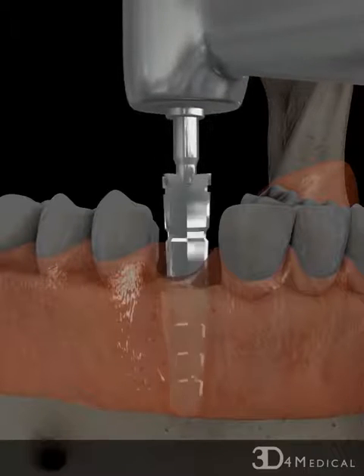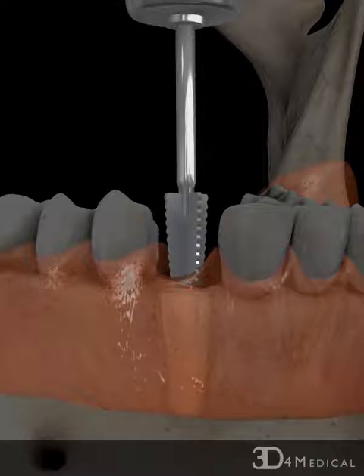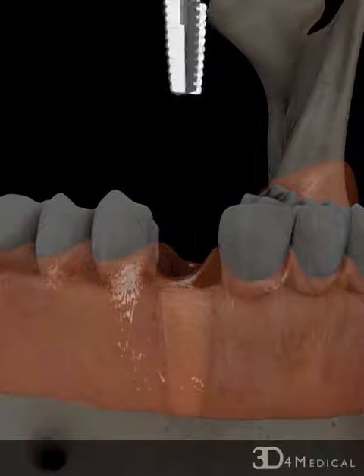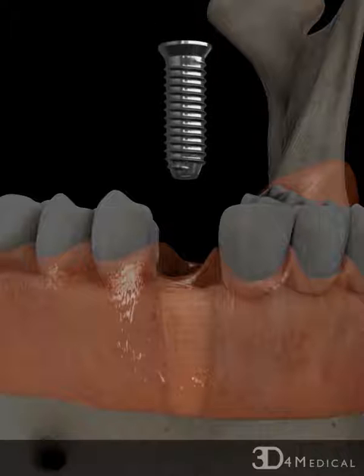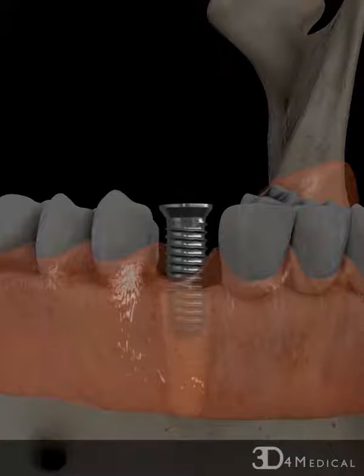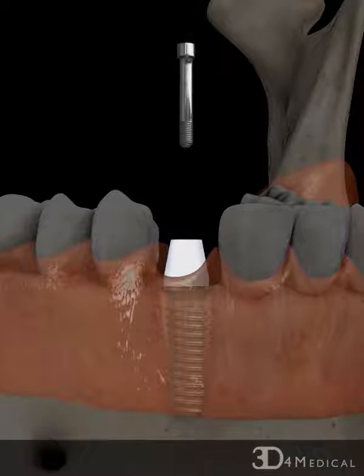Threads are then cut in the socket and the implant is inserted into the jawbone. A zirconia abutment is placed on top of the implant and secured using a screw. Zirconia is used because it gives a better aesthetic appearance than other materials.